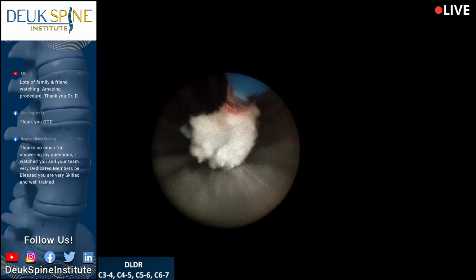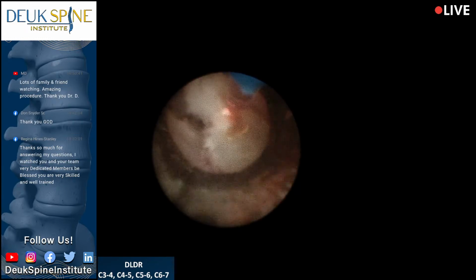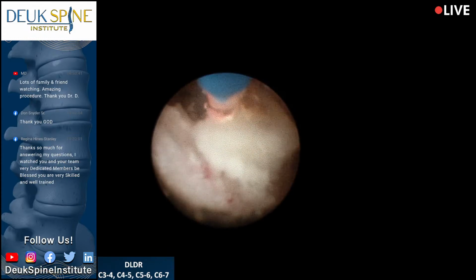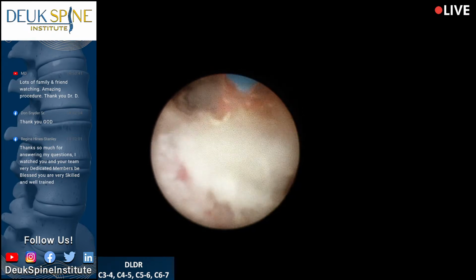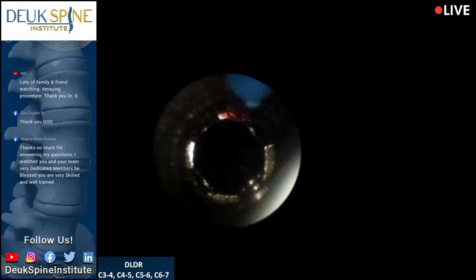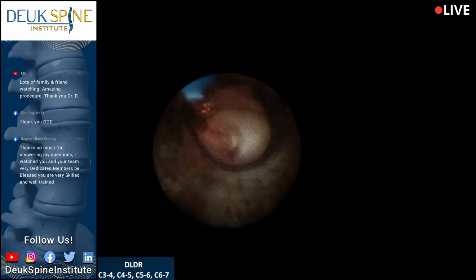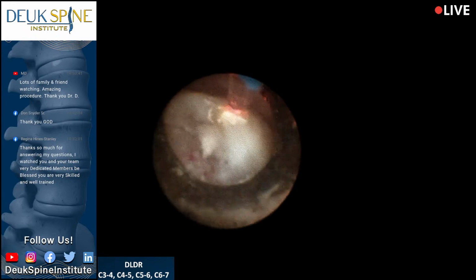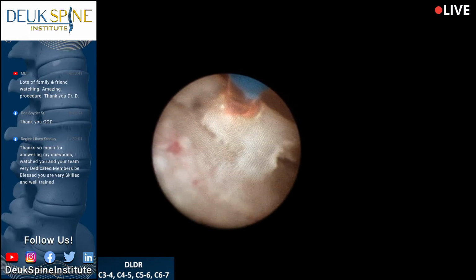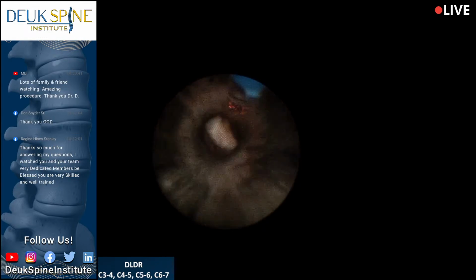All right, so this is a giant herniation. I've been breaking it up into little pieces so I can deliver it. You know, my dad was an OB-GYN. He wanted me to be an OB-GYN. I said, there's no way I'm going to become an OB-GYN. But here I am delivering just like he did. He said, I don't deliver babies, I deliver herniated discs. It's odd, isn't it, how that worked out? Look at this piece. This herniation is huge. It doesn't want to come out.